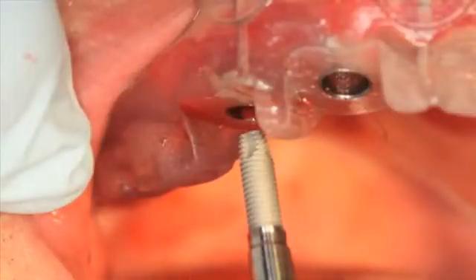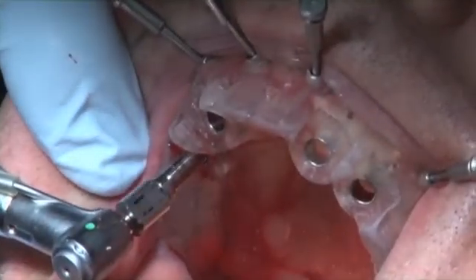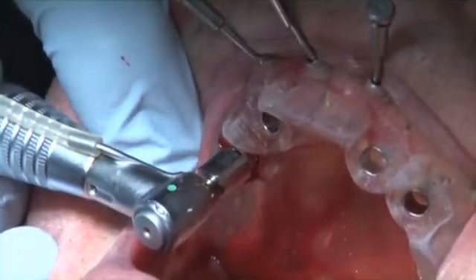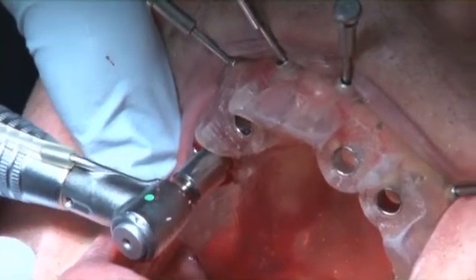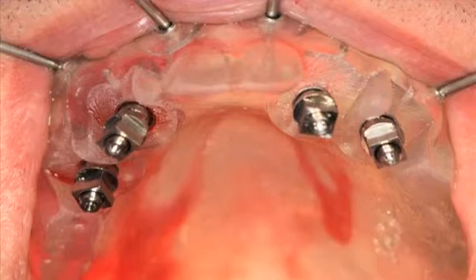Figure 14 and Video 4 show the desired implant, which is then ratcheted to the predetermined depth using the stable surgical guide. We actually place the implant through the surgical guide and torque the implant into proper position. Remember, this was all virtually determined prior to any surgical intervention. Figure 15 shows all four dental implants precisely placed by the computer-aided virtual design of the surgical guide.